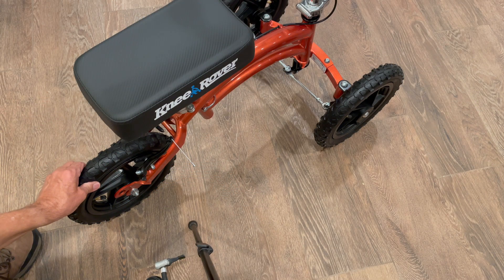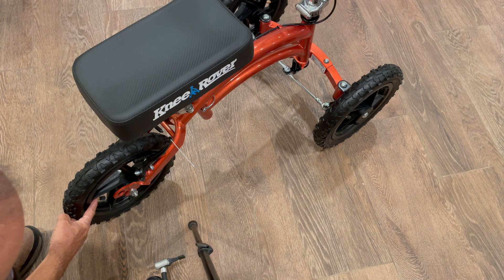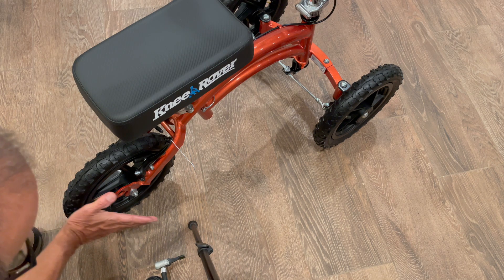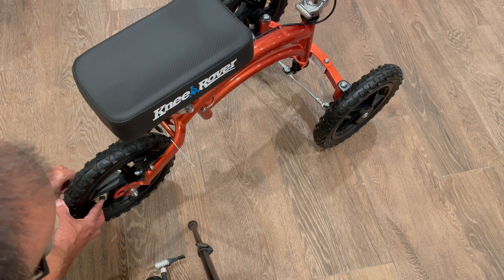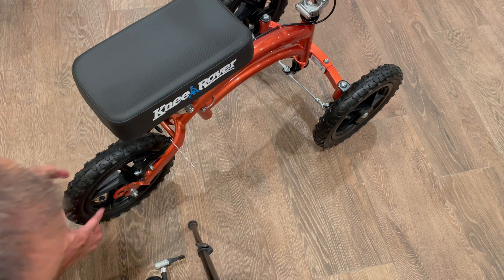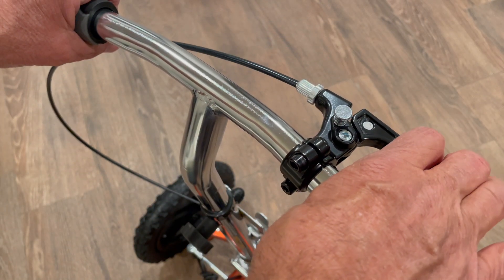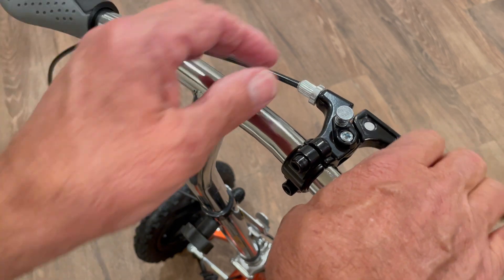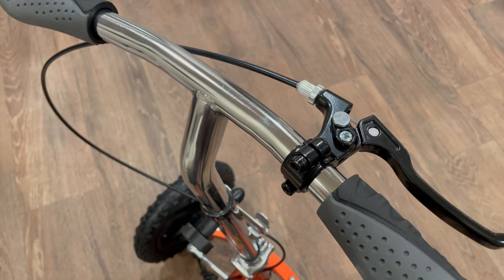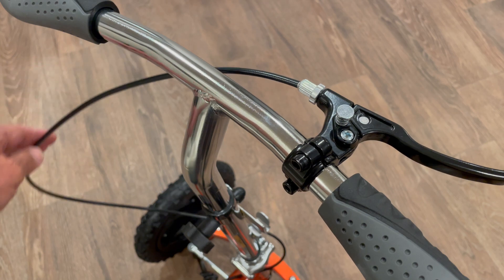The tires come inflated with very little pressure, so I'm going to add some air to the tires, and I want to warn you about something. Take a look at this valve stem — it comes out of the tire at an angle. I didn't know that on the first tire I filled up. Generally bicycle valve stems come straight out, but if you try to connect from the other side, you won't be able to get your pump connected. Make sure you adjust the brakes properly — I had to do a little adjusting on mine. The lock is easily put on and snapped off, so make sure you understand how that works before you hop on and start scooting around.